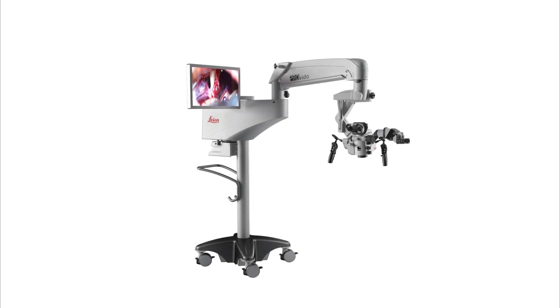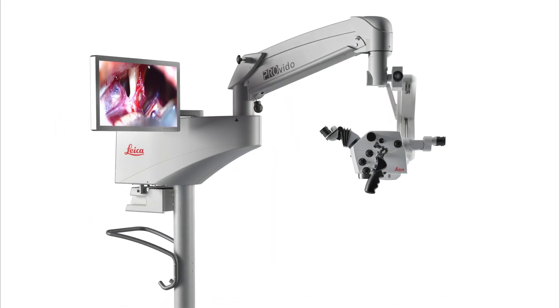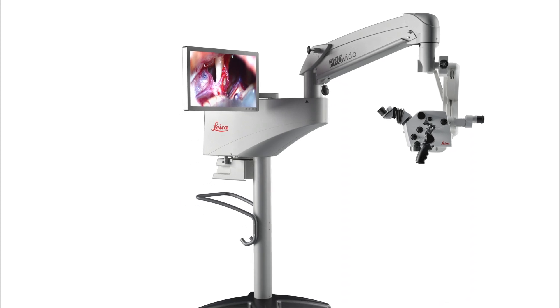Before draping the microscope, make sure the binocular tubes are configured in the correct position and check that the balancing has been done properly.